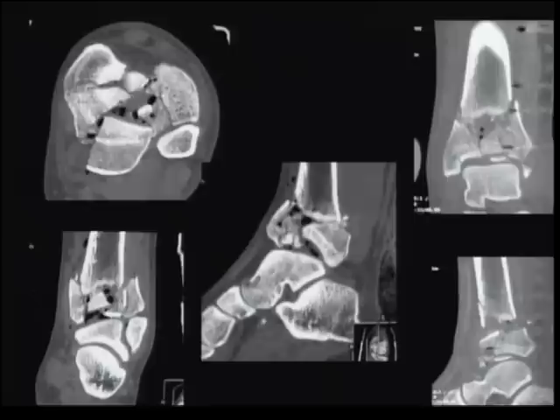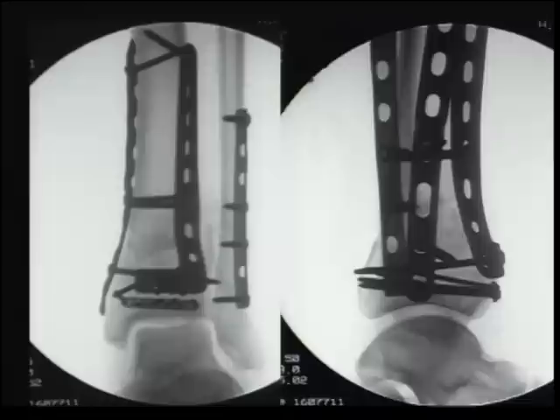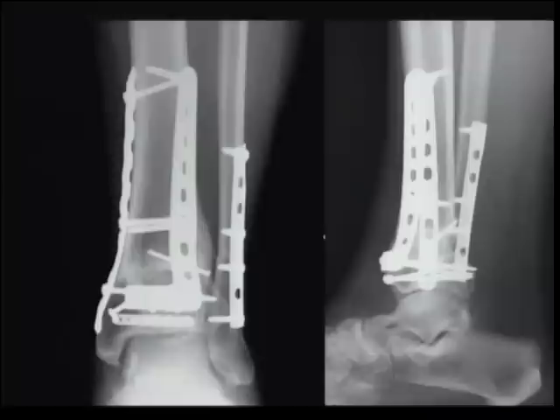And so I think that decreases the complexity of these injuries because at least there's something to build to beginning from that posterolateral segment. So one can work from the back to the front, derotating that, and then slowly piecing back together the intercalary articular segments and going through the same reduction maneuvers needed to put the joint back together, some type of fixation then to secure the articular fragments, and then plates to secure the articular segment to the diaphysis of the tibia. This is that patient then at 2 years. There's certainly arthritic changes at the ankle joint, but I think the overall anatomy of the distal tibia is well maintained thus far.